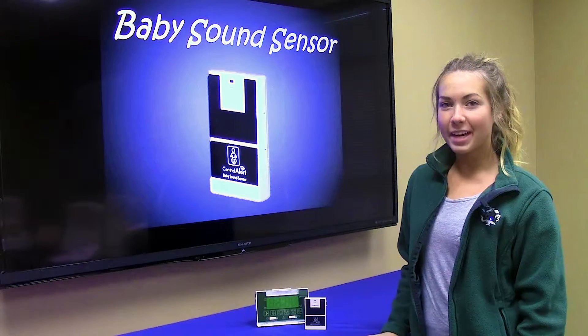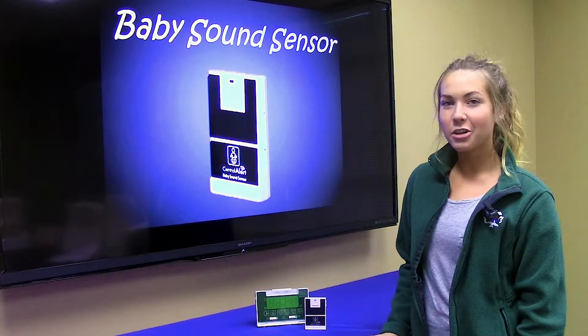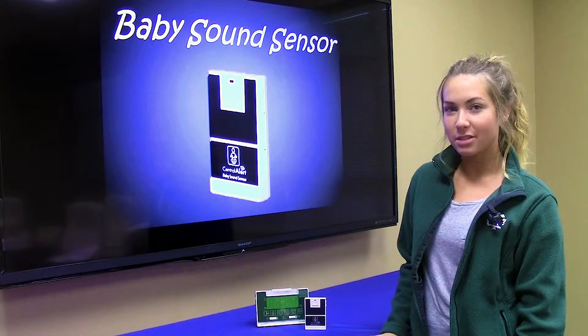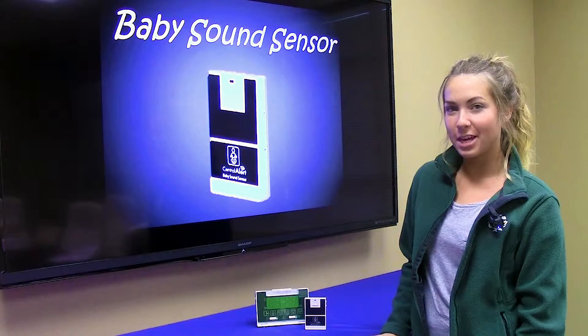Hi everyone, Madison from Oak Tree Products. In the last quick flick, I introduced the CA360. In this quick flick, I will be talking about the wireless baby sound sensor and how it hooks up to your CA360.